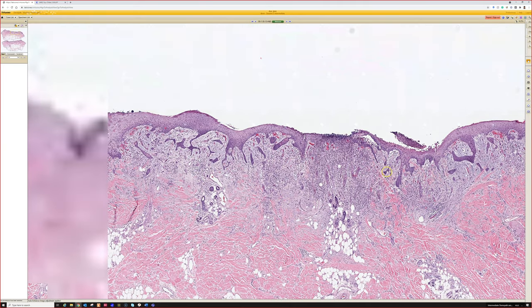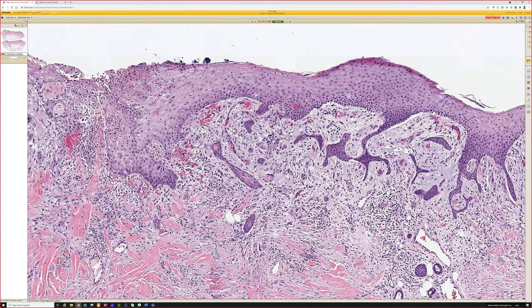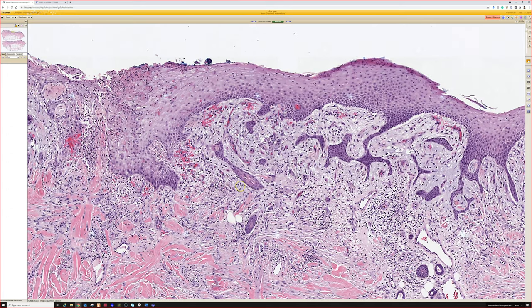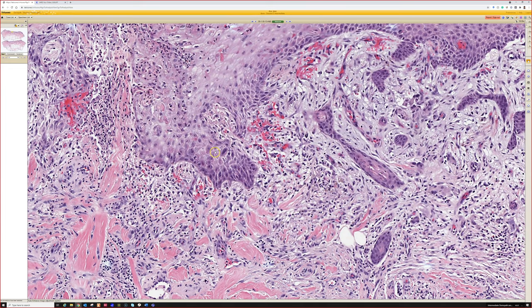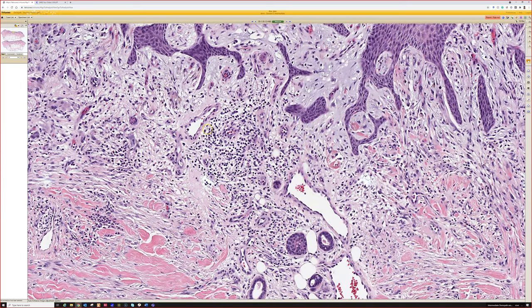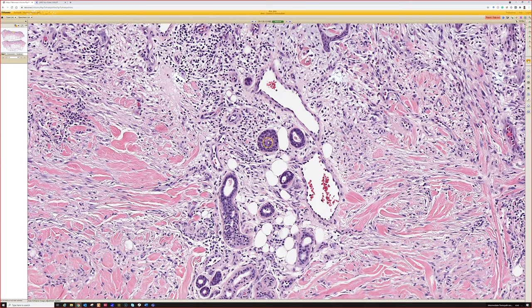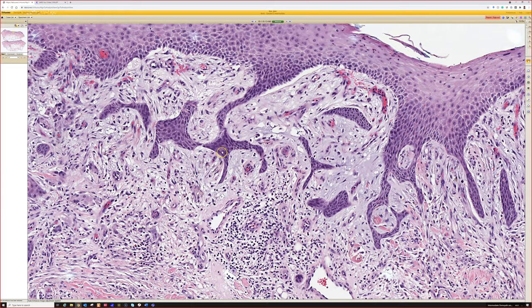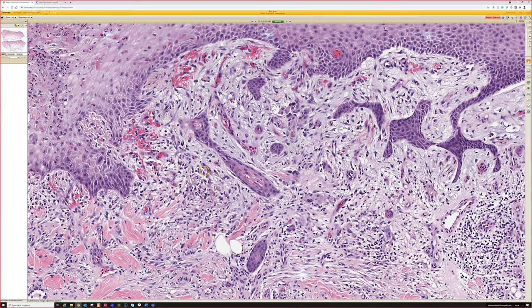Here again, this jagged epidermal change. So yes, if you're watching this at home, study biopsy site changes, especially when you know it's not squamous. Like if it's a melanoma excision, that's a perfect time. Go look at how weird the epidermis looks and how atypical the reactive regrowing keratinocytes can look and how weird the sweat ducts look. See the duct lumens there? That's how you know this is syringometaplasia. You find the duct lumens. And oftentimes you can see it kind of transition down into more obvious ducts down below. See, it's just starting here. And then the closer we get up to where the cut was made with the biopsy, the more weird and bizarre these little acrosyringeal structures get.